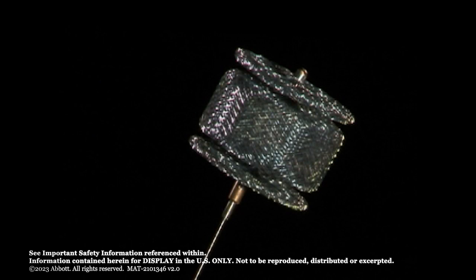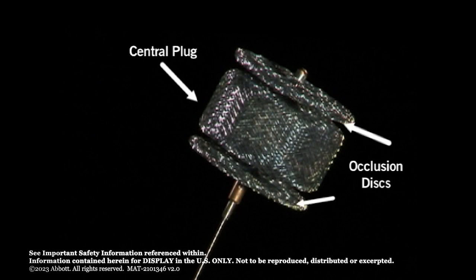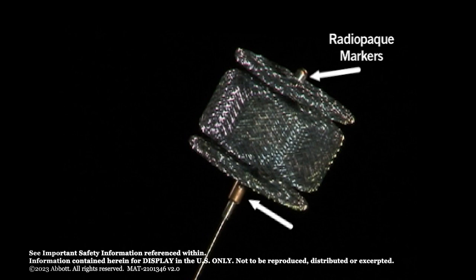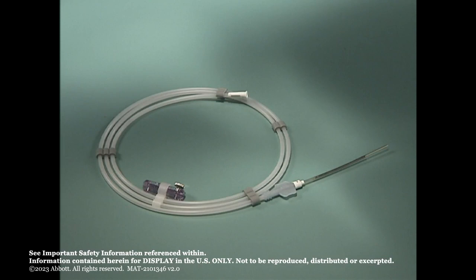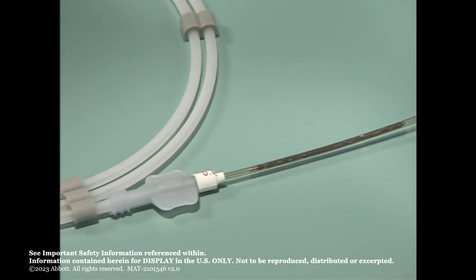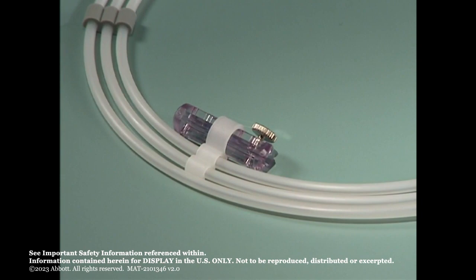The Amplatzer Vascular Plug 2 is a cylindrical shaped nitinol mesh occluder with a central plug and occlusion discs at each end. There are radiopaque markers at the distal and proximal ends of the device. A proximal micro screw attaches the occluder to the nitinol delivery wire for delivery and release. Each plug comes attached to a 135 cm nitinol delivery wire. The device comes pre-loaded in the loader with the delivery wire in the hoop dispenser and a plastic vise for wire rotation at release.